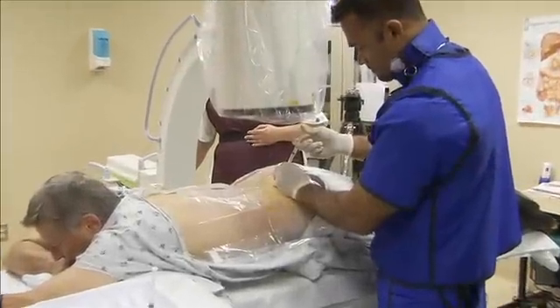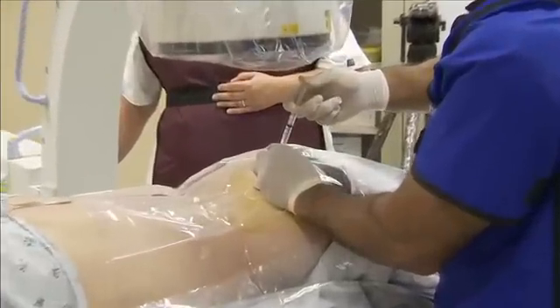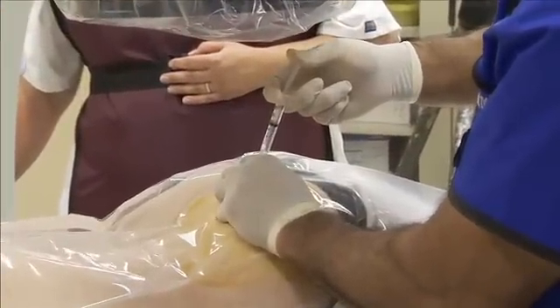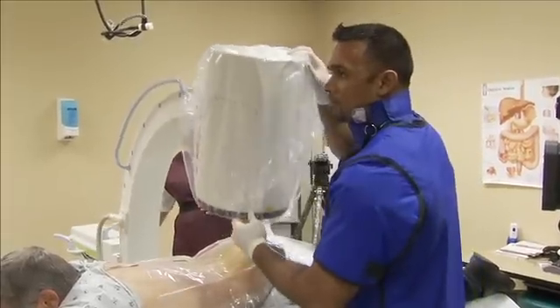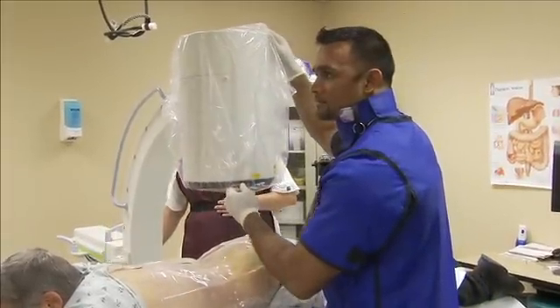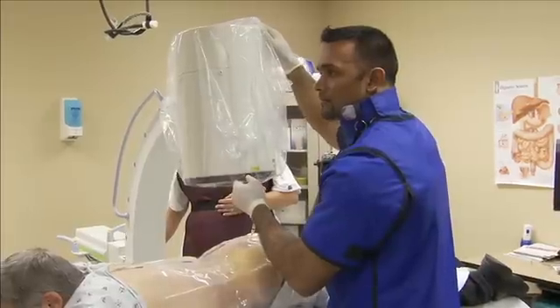Dr. Amish Patel will discuss and demonstrate the recommended technique for SI joint injection. Typically, the current gold standard is that SI joint injection should be performed under fluoroscopic guidance, utilizing contrast to confirm needle placement, injecting no more than two cc's of solution, whether it's a diagnostic and/or a therapeutic injection.